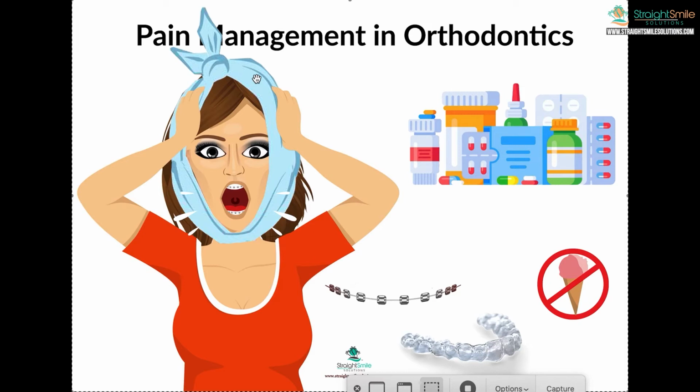You got it. So let's start first with the rubbing part. And we're going to be making some more videos on this using wax, using orthodots, stuff like that, to manage the rubbing and discomfort. Make sure you're sending your patient home with a take-home kit. You can buy these on eBay, Etsy, Amazon, but you can also buy the components from any ortho distributor.